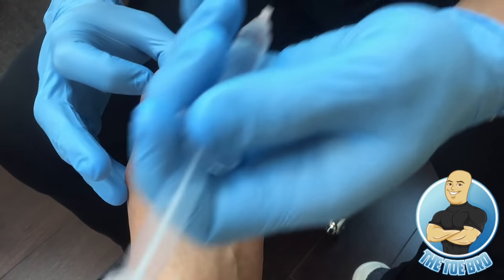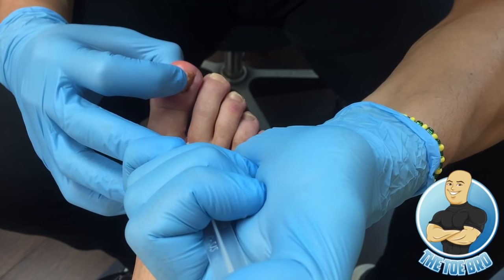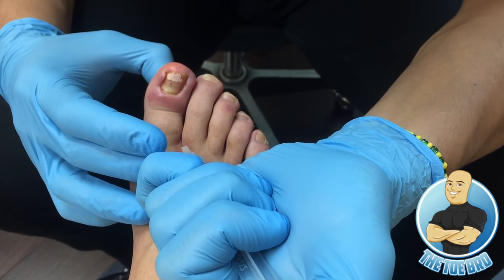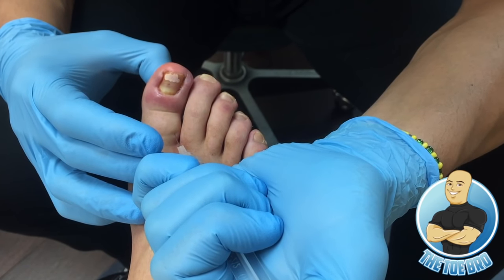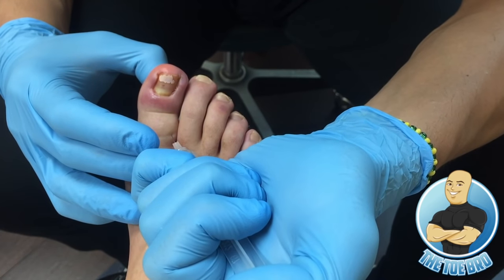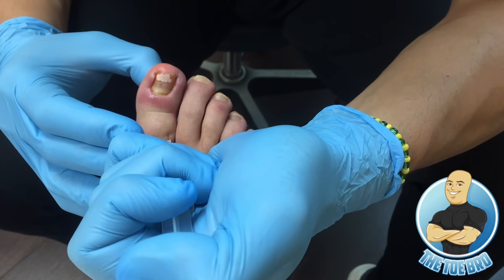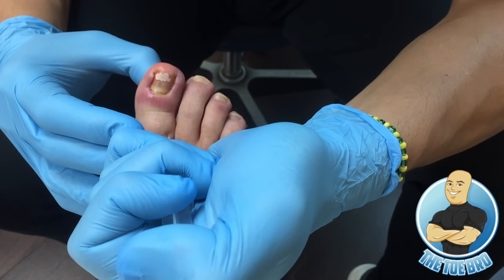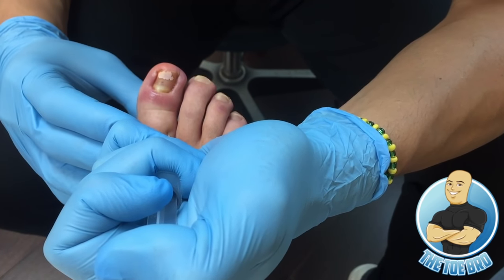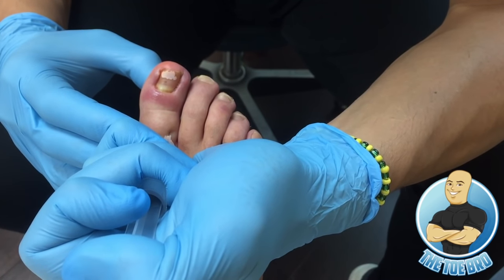Okay, so here we go. A little pinch. So on three, you can push your heel into the chair if you feel pain. One, two, three. Yeah, that's the pinch. And now it stings. You okay? Yeah. You're not even flinching. You okay? Yeah. See? Is that bad? No. You're doing really well. Are you watching? She's gonna faint. Any pain? No. No pain? No. There you go.